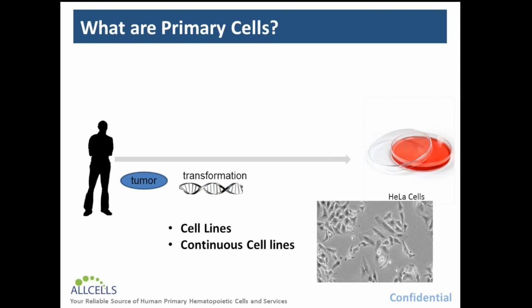The tumor is dissociated into a cell suspension and put into culture with different growth mediums. If the culture is slow growing, the researcher may try to enhance its growth by transforming the cells with a virus, often the EBV virus. If the culture continues to propagate, the researcher will continue to subculture it, intentionally or unintentionally selecting for the fastest growing cells. At any point and at any level of confluence, the cells can be frozen for storage, shipped to collaborators, and thawed for another round of subculturing in a different lab. The end user often has no knowledge of the subculture history.